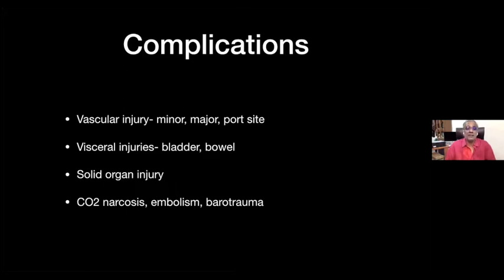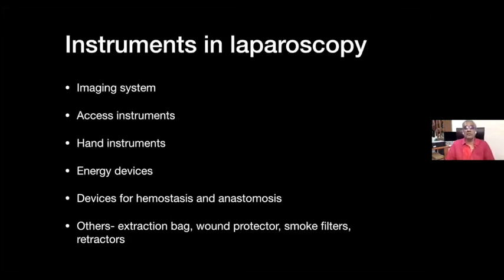Okay, we get vascular injury, which are of varying gradient. Okay, visceral injuries, solid organ injuries, sometimes complications related to the use of the gas. Okay, so with this in mind, I will go on to the instruments in laparoscopy and tell you what instruments are being used, what strides we have made in terms of development of instruments, and possibly how to choose when to use the instrument.